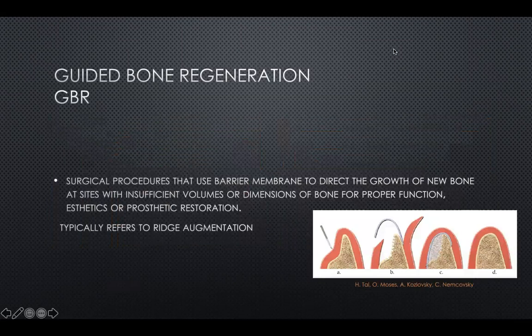So now I'm going to be, again, switching gears to a different topic. It's going to be our last topic, and I'm going to go over it briefly. We all know about guided bone regeneration and the need to do a ridge augmentation for our implants if there is not enough bone to place our implants, and to have sufficient stability and sufficient thickness of the bone all around our implants.